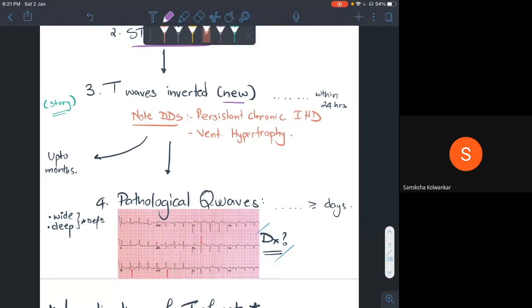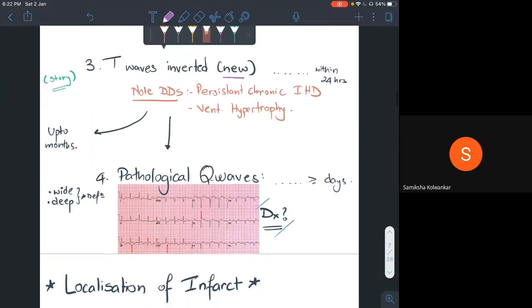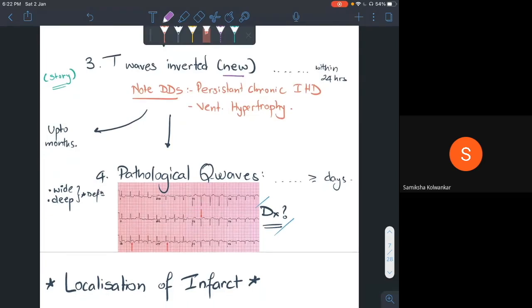It indicates that this person at some point today or yesterday has had a small MI. So you need to start them on MI medications like anticoagulants, etc., depending on the situation. But don't rule him out as just acidity if he comes in and there's no ST elevation, right?